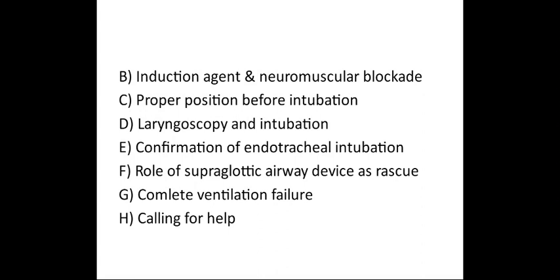Presence of 6 consistent capnography traces without decline in CO2 levels will confirm the endotracheal tube intubation. Next, the role of supraglottic airway devices as a rescue device during difficult airway. When the endotracheal tube fails, placement of a supraglottic airway device helps in maintaining oxygenation.